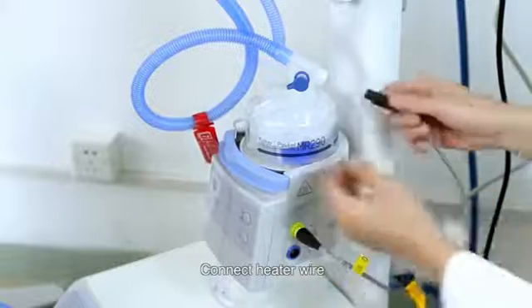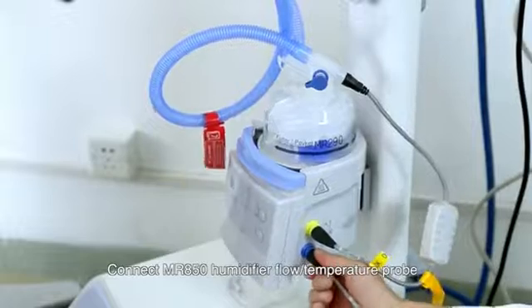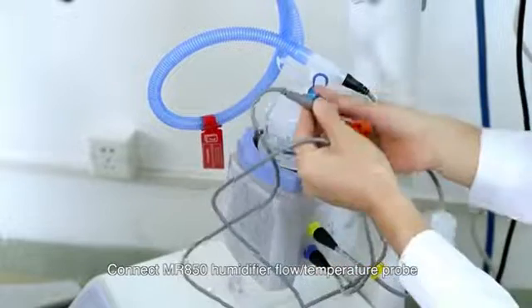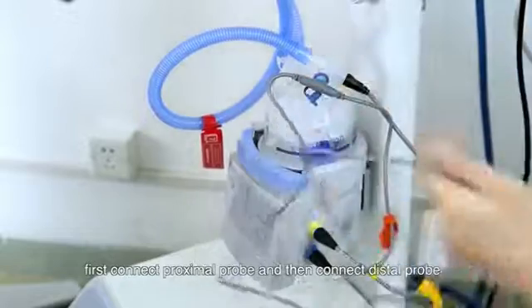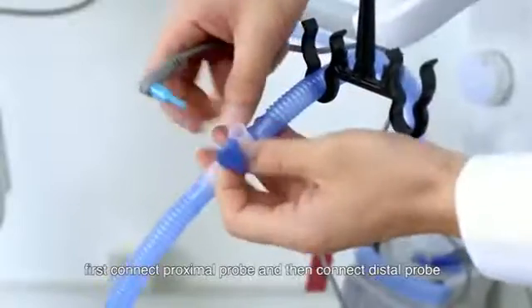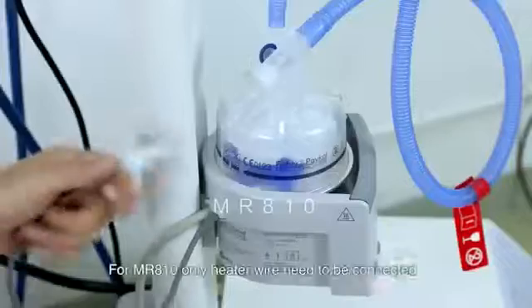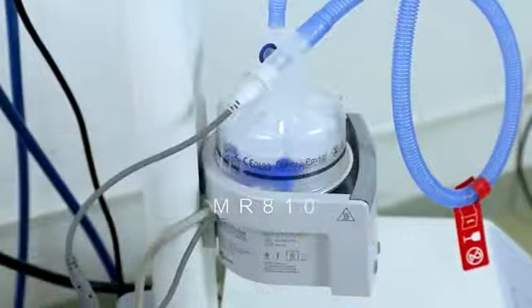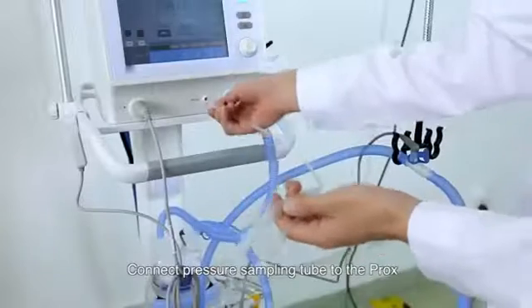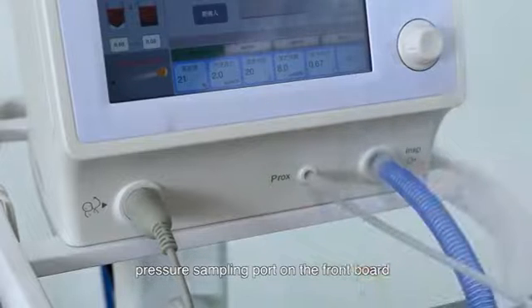Connect the heater wire. Connect the MR850 humidifier flow temperature probe. First connect the proximal probe and then connect the distal probe. For MR810, only the heater wire needs to be connected. Connect the pressure sampling tube to the prox pressure sampling port on the front board.